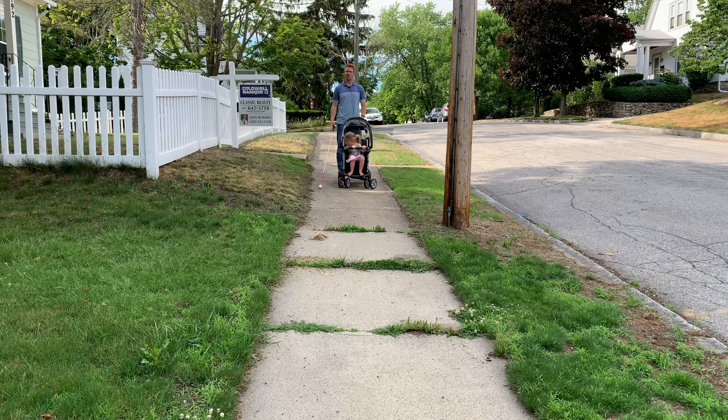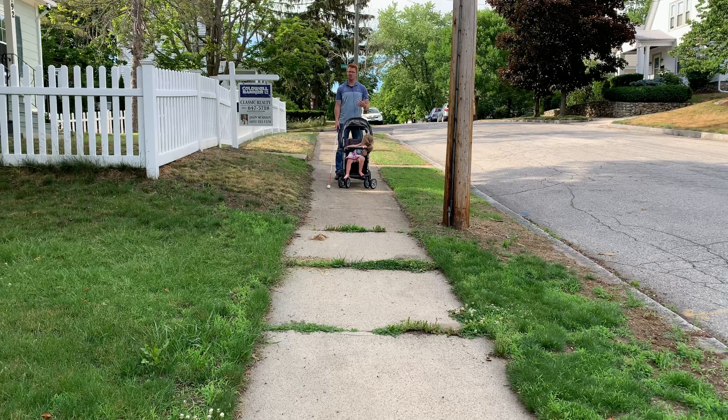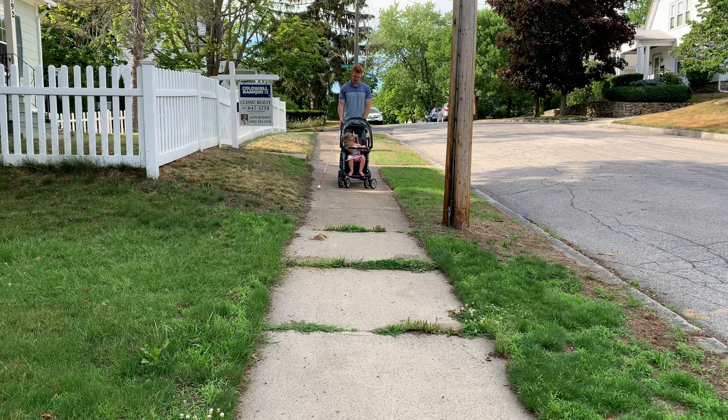To start my demonstration, I first want to talk about why using a standard push stroller with a white cane is not recommended, and then I'll share with you some other alternatives that might be more useful and helpful. Here I am on a residential sidewalk and I have a push stroller in front of me. First, it's really hard to use the cane. The stroller is taking up pretty much all the space in front of me, so the cane can only go to one side or the other.